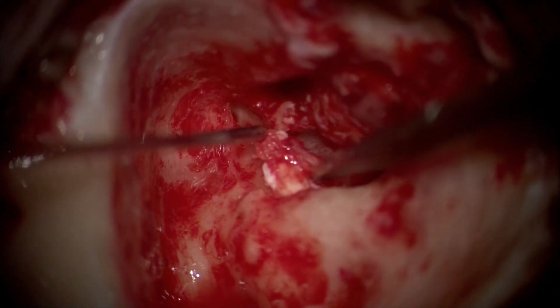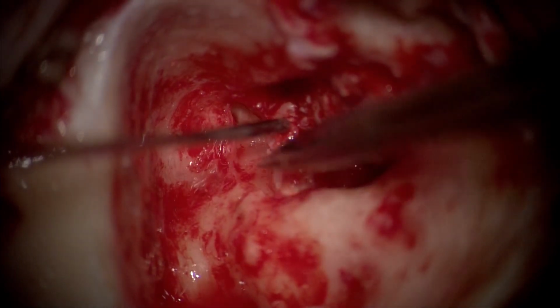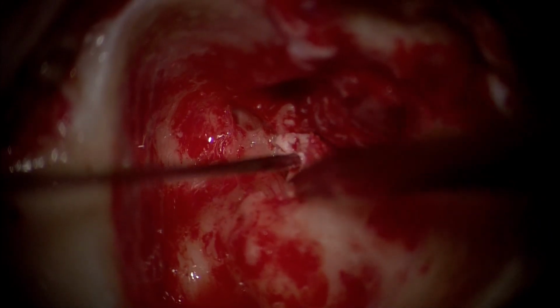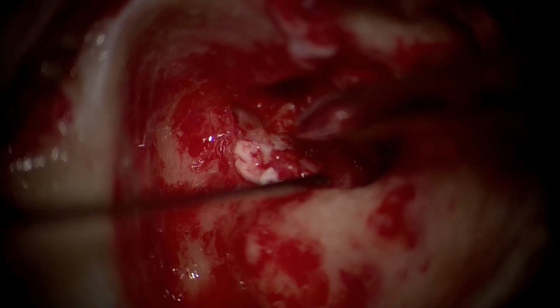And you see how, with very light traction, with a thin and appropriate suction, and with sharp dissection, we can start getting the cholesteatoma sac en bloc from this very vital region of the second genu of the facial nerve.